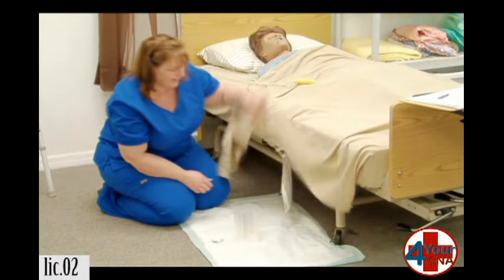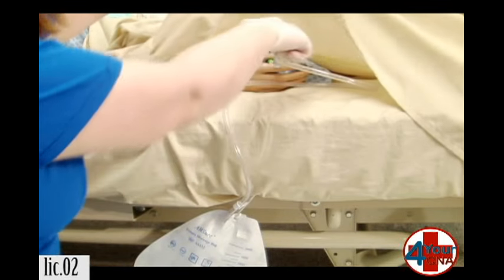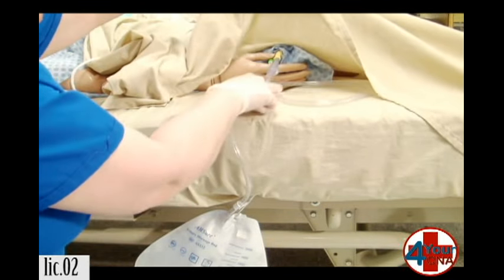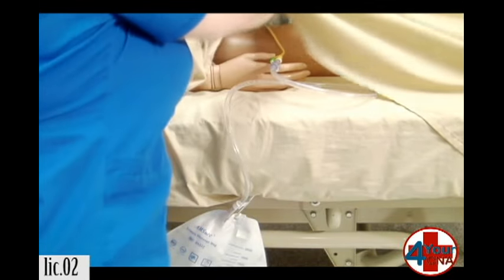We're going to open the alcohol pad and set it aside. I want to take a quick look at the urinary drainage tubing — make sure it's not kinked, it's not laying on the floor. Make sure you're not laying on your catheter so that the urine can flow freely. Everything looks good.